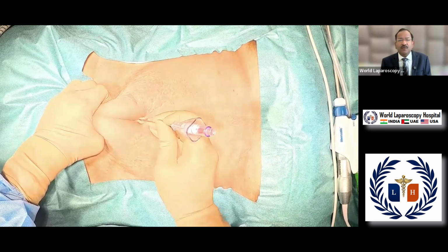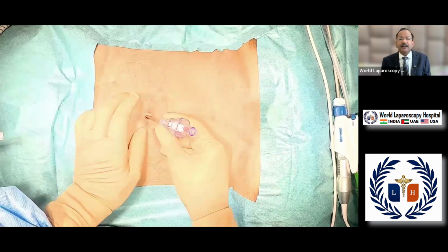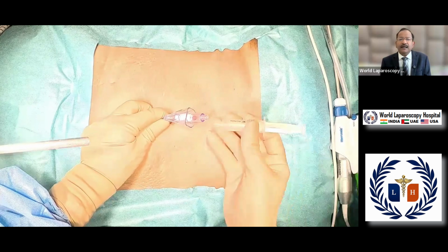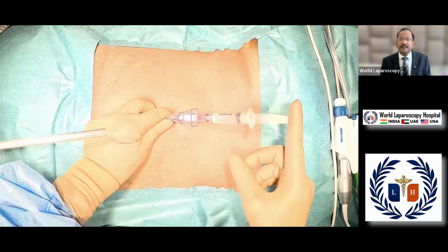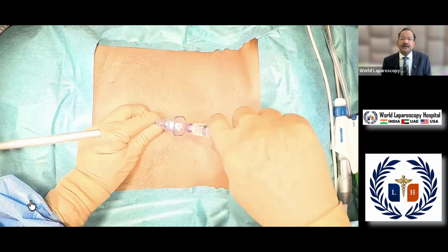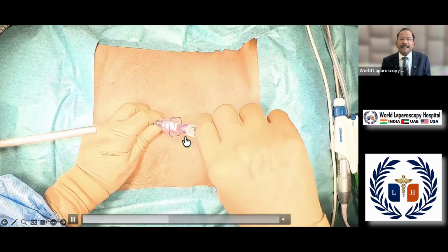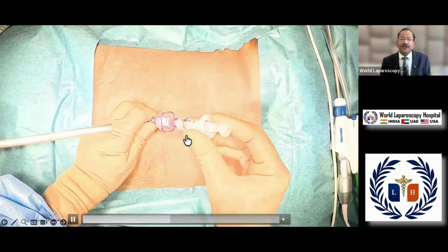And this is pointing, and then 1 click and 2 clicks. After that, you take a syringe and do the irrigation test. It should go freely. Suction test, nothing should come out, only bubbles should come out. And then the hanging drop test.